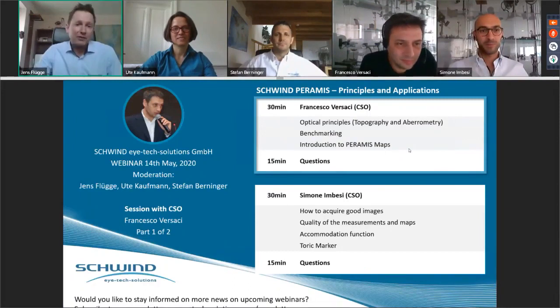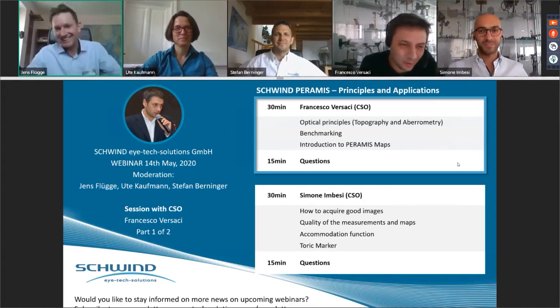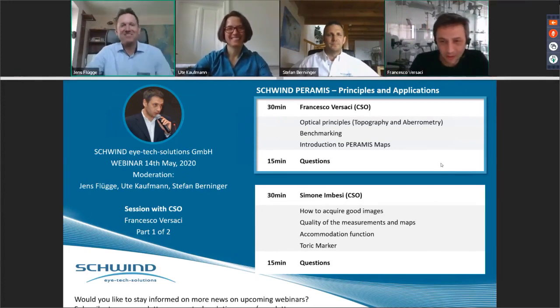And we will start with Francesco Versaci, who will talk about Aberrometry and its principles. I'm very happy. Thank you very much for being here, Francesco. And hello, thank you for inviting me. My great pleasure. Please go ahead.